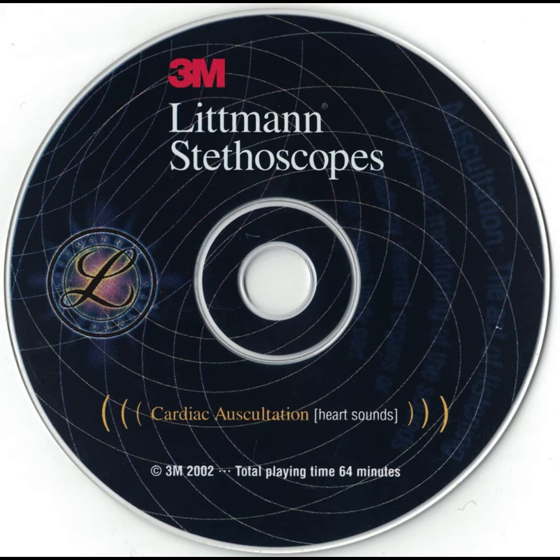Third heart sound. The third heart sound is also of low frequency, but it is heard just after the second heart sound. It occurs in early diastole, during the time of rapid ventricular filling. This sound occurs about 140 to 160 milliseconds after the second sound. The S3 is often heard in normal children or young adults, but when heard in individuals over the age of 40, it usually reflects cardiac disease characterized by ventricular dilatation, decreased systolic function, and elevated ventricular diastolic filling pressure.